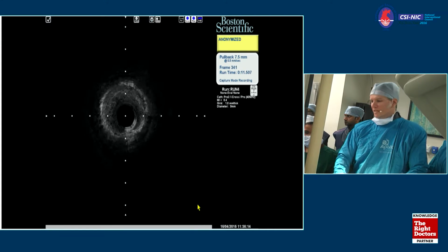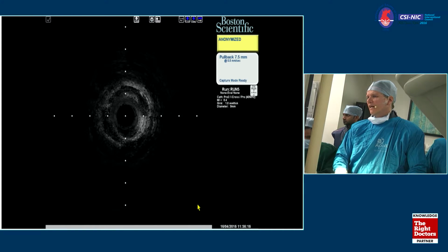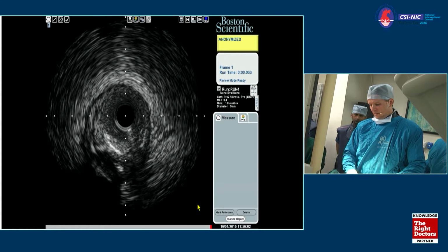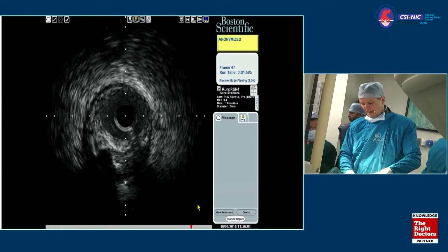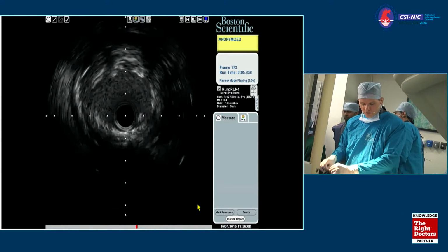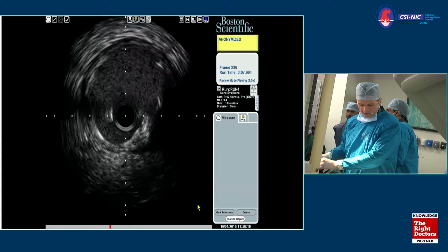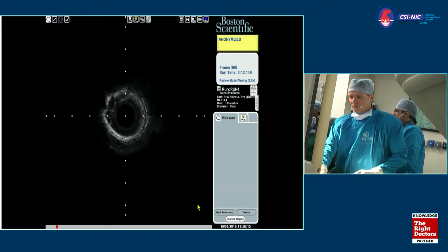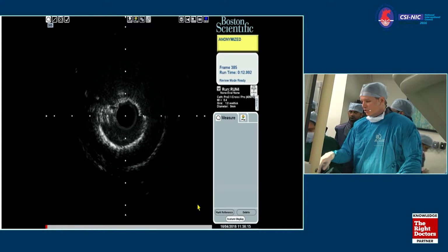So my strategy is clear. After the IVUS, I will do a 4.0, 12 millimeter stent for the LAD. Then I will do kissing again, and I will finish with a 4.5 POT. I will finish with a 4.5 POT. So if you want to disconnect, this is my strategy. You want to see a final shot, right, how we look at the moment?